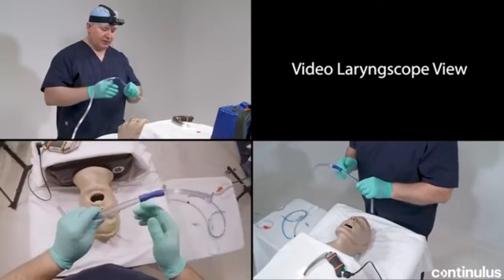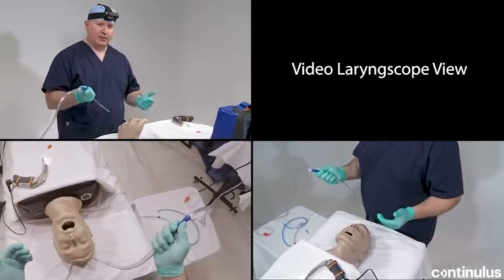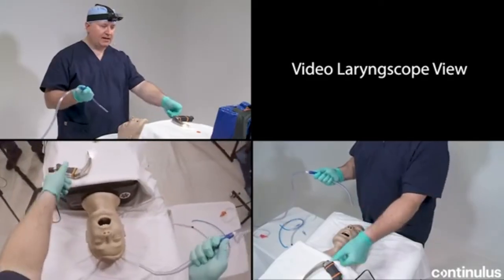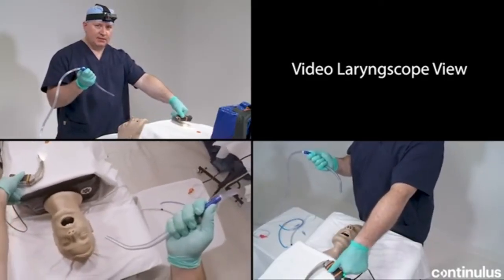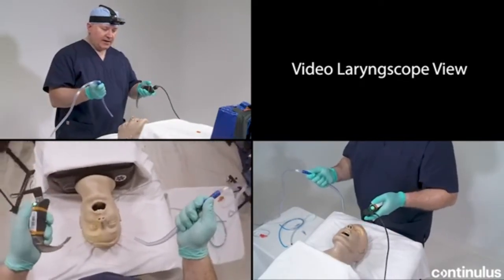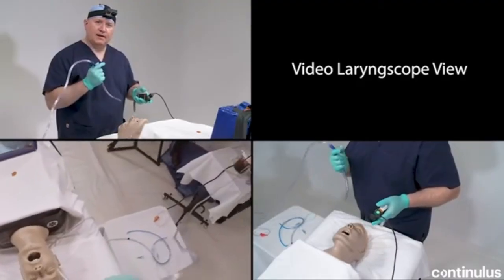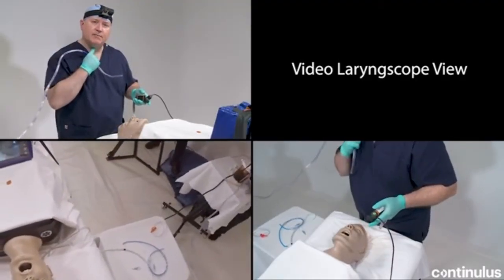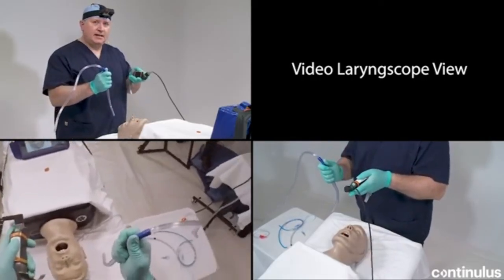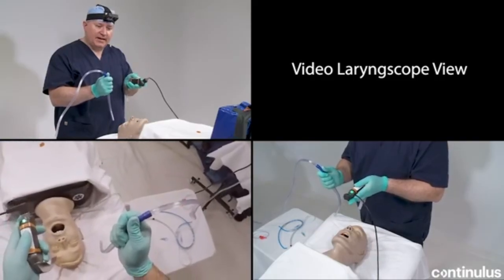I'm going to start with an overhand grip, and what I'm going to do is simultaneously evacuate the airway contaminant from the pharynx of the mannequin, and I'm going to use the suction as a tool in order to distract the lower mandible, contain the tongue into the floor of the mouth and into the thyromental distance of the mannequin.